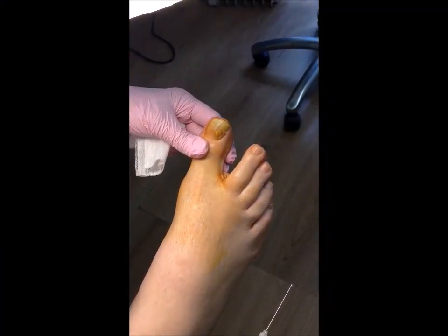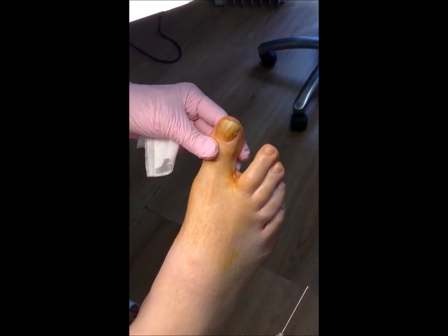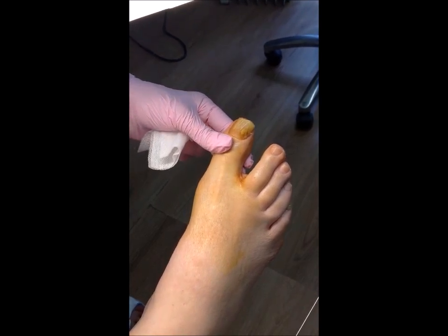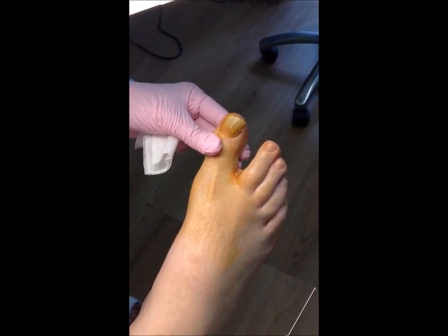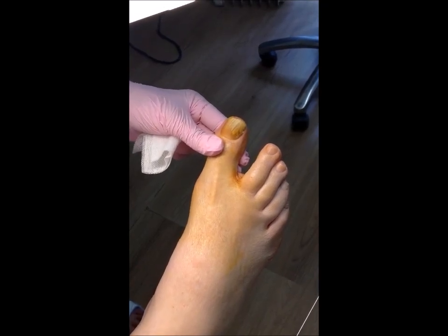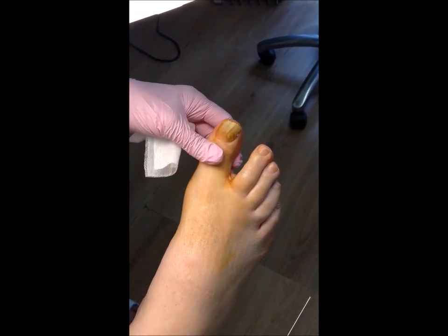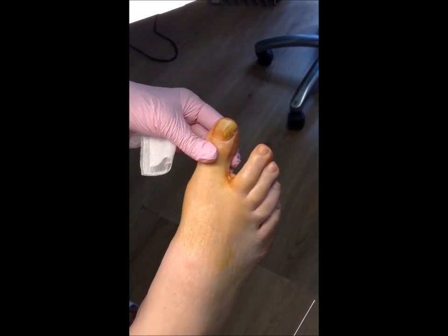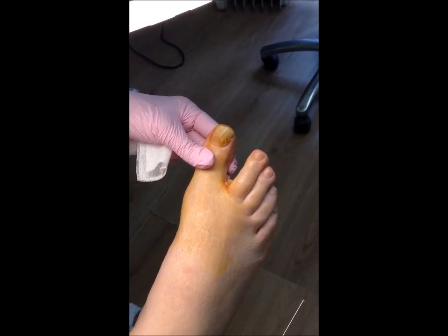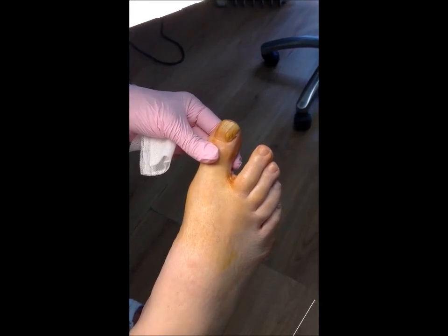I'm here today to demonstrate the surgical removal of a fungal toenail. As you can see, this toenail has got a severe fungal nail infection and my patient has had this infection for well over five years. Nothing is really working to treat this infection, so the best treatment option is to take the nail off and totally avulse it, then give my gentleman a course of Lunula laser treatments at weekly intervals.